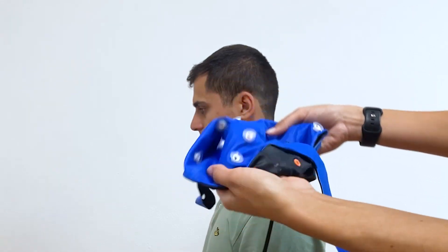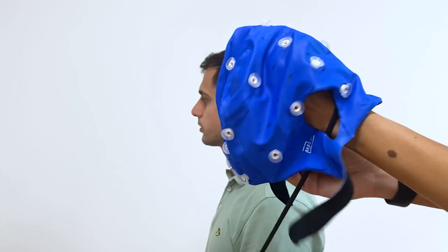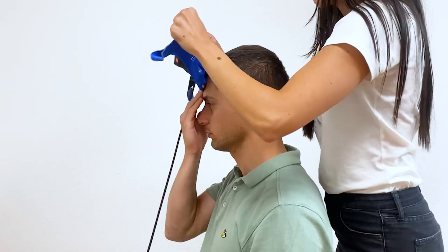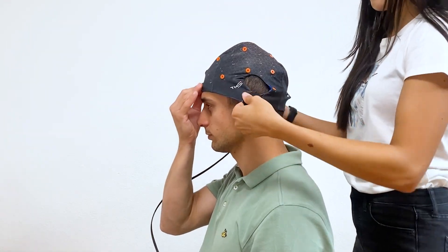After selecting the correct sized head cap, place the head cap on your participant by inverting the head cap and asking the participant to hold down the three frontal electrodes. Then slide the head cap over the rest of the head and secure the chin strap.